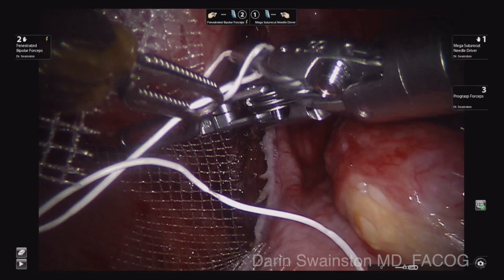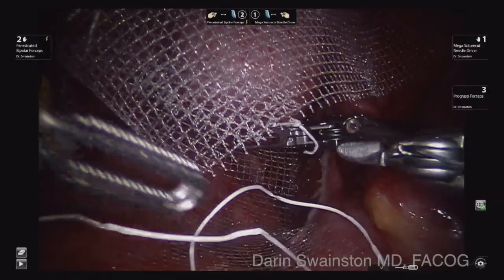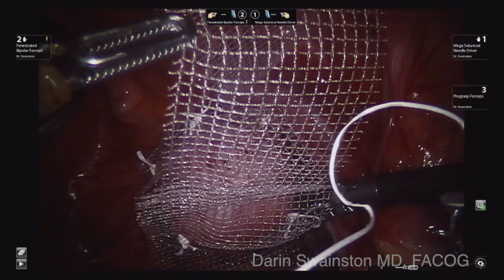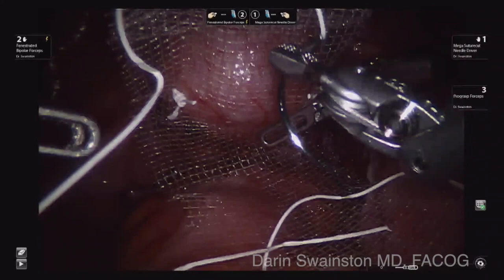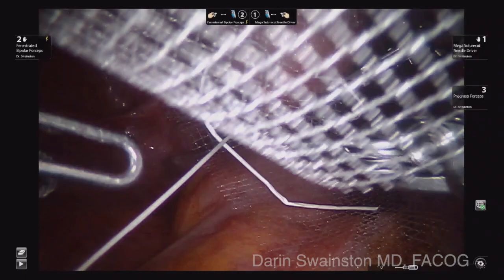Whether you leave the cervix or take it, I like to leave that little Y area above it — I find that works better. Now that I have done the second suture placement, I can really just see: is this the right level? Is that the right amount of tension anterior and posterior? It looks pretty good. I like having that Y above the top because I am not committed to wrapping the mesh around, hoping I got the right tension. I can decide how much tension to put on one side versus another — slightly more tension posterior than anterior.